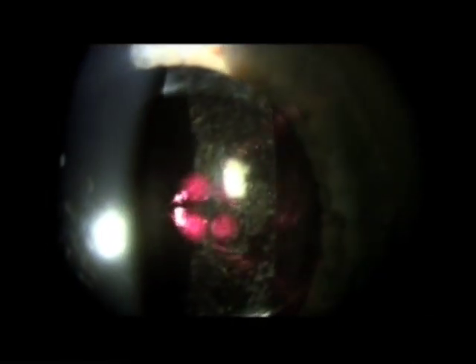Some of the better lasers have offsets that allow you to treat just behind or just ahead of the spot you want to treat, so that you don't damage the lens. Here you can see us making an opening into that capsule, resulting in a relatively clear view afterwards. Here's another view of some clouding of the posterior capsule — the laser beams are focused right on it, and you'll see the laser fire. A small opening is created, and so instead of looking through wax paper, the patient is looking through the opening.